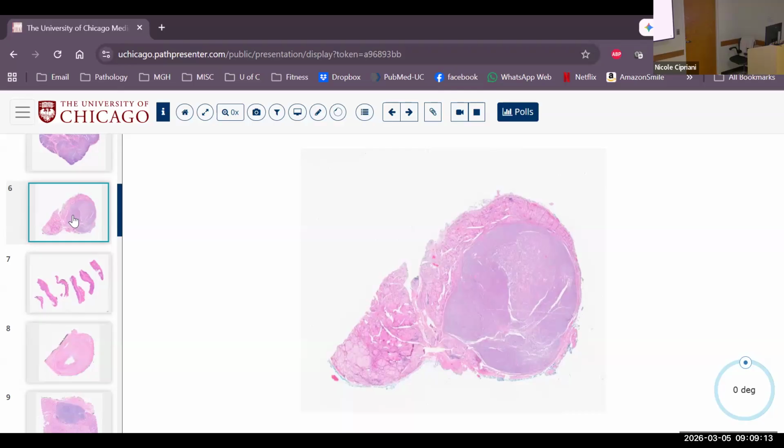Check the patient. With the NTRK ones, if you don't have fusion studies before, do it. But how would you sign it out? Would you wait for fusion studies if you had a suspicion for NTRK? No, I would probably just, these technically are still under papillary. So you could, in all good conscience, call it PTC and just say this is BRAF negative, I suspect a fusion, do the fusion. That's what we've kind of been doing, because for now, they're still PTCs.